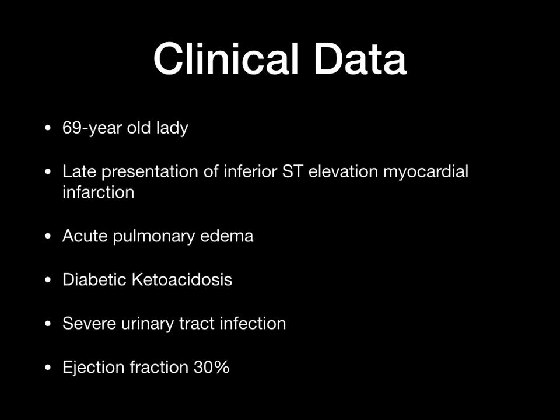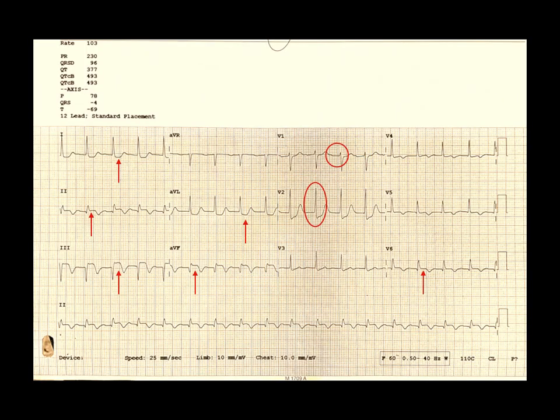Her bedside echo showed an ejection fraction of 30% and moderate mitral incompetence. Her electrocardiogram showed sinus tachycardia with a heart rate of 103 per minute, and you can appreciate the first-degree heart block, ST-segment elevation in leads 2, 3, AVF, with slight elevation also in V6. You can see the reciprocal depression in leads 1 and AVL, with a tall R in V2 suggesting a posterior and inferior infarction with probable culprit of the right coronary artery.